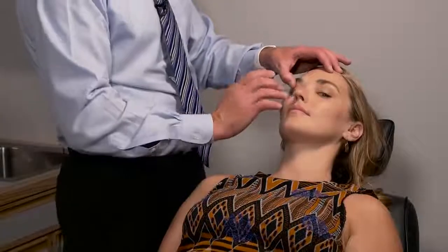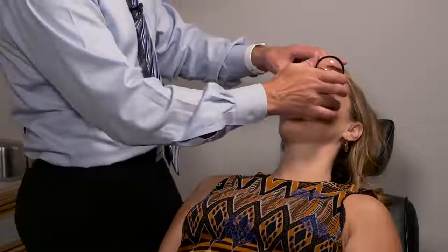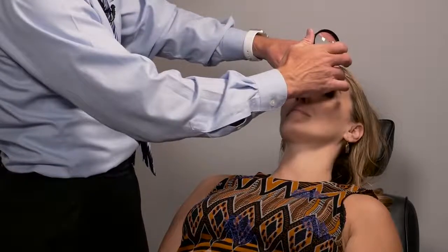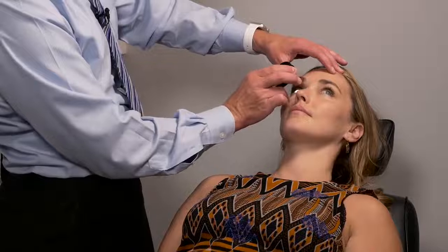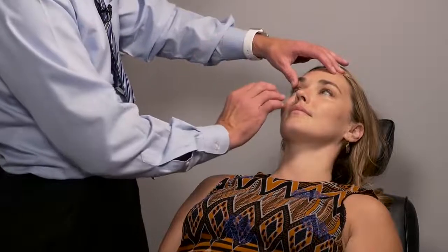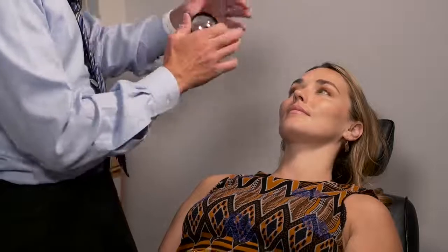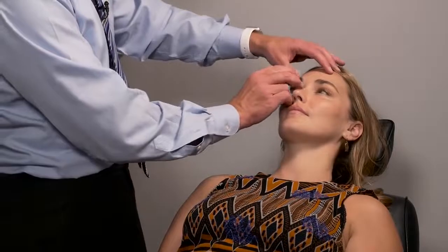So look down and to the left, and then over to the left, and I'll just kind of tap where I want them to look, lightly. You don't want to pound them, obviously. Look up and to the left, and then I have them at the very end look right at me. And at that right-at-me exam, I get a good view of the nerve, the blood vessels, the macula again. And then that's the exam for the right eye.